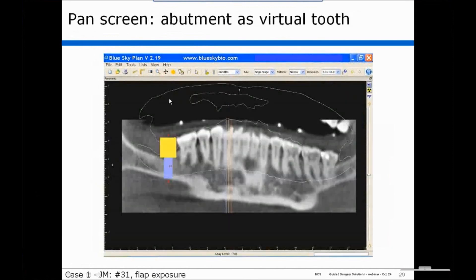We next go to the panoramic screen, and here we would size the implant — in this case maybe a 5 by 11.5 implant. We use the abutment as a virtual tooth; here it was sized at about 10 millimeter diameter. You can move this into position and see your mesial-distal orientation, moving your abutment against the distal of the tooth, so your implant is in a pretty nice position.